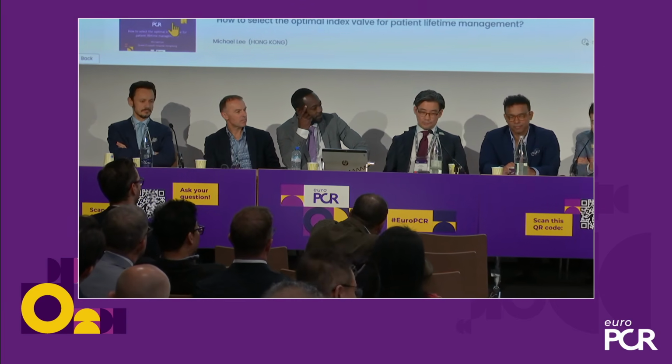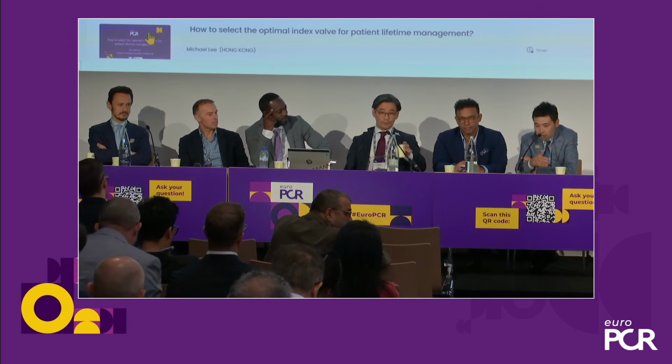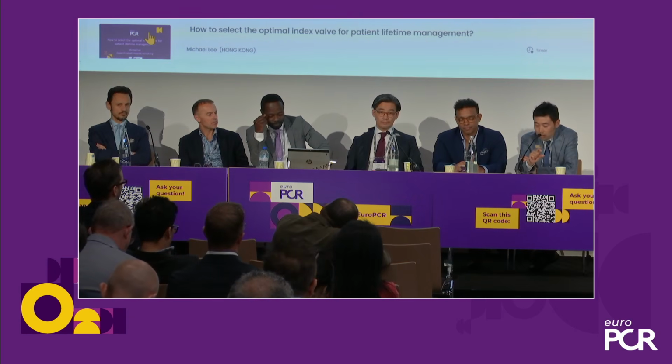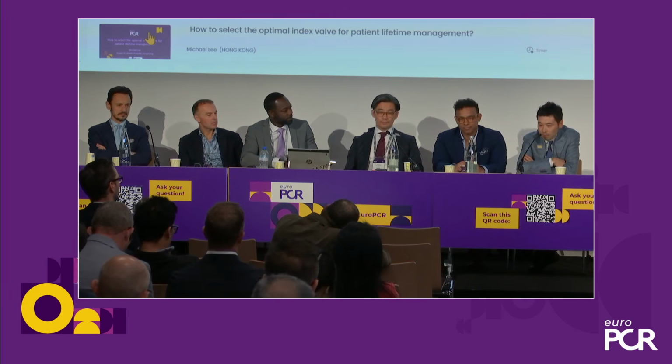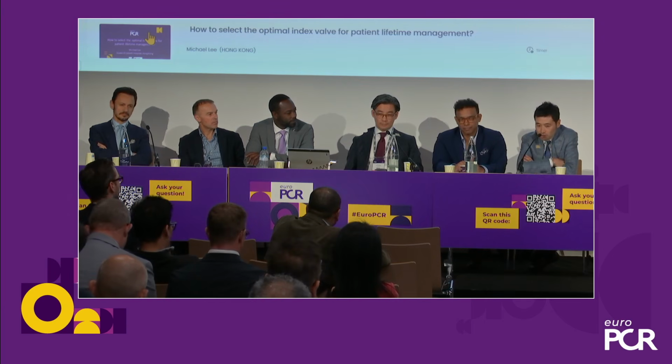Well, great discussion, Didier. But I believe the index procedure should be highlighted more than the potential future redo TAVI, because you never know if the patient will need it or not. Of course, very young patients could have a higher chance of having a redo procedure. But I would like to focus on the index procedure because, as I mentioned, if we develop a pacemaker, there is a negative impact on cardiac function in the long run. So I would still focus on not going too aggressively shallow, because I learned from Michael's talk that some room for going slightly low can increase the chance of future coronary access.